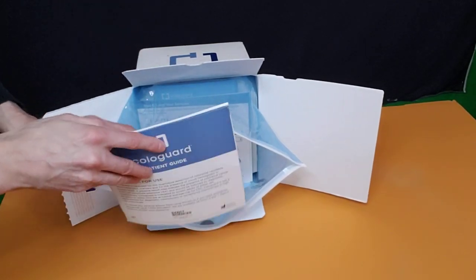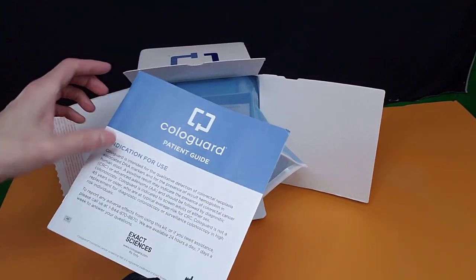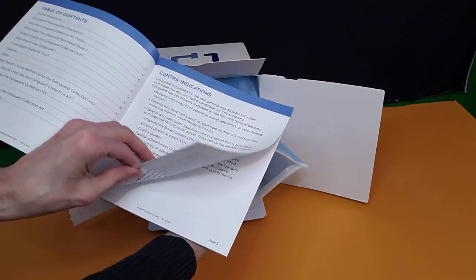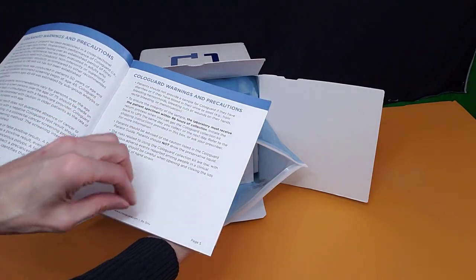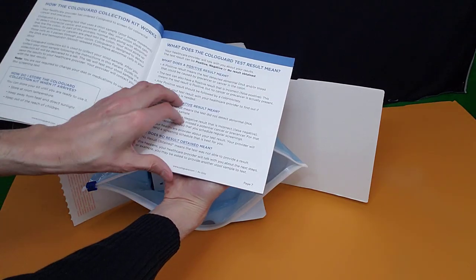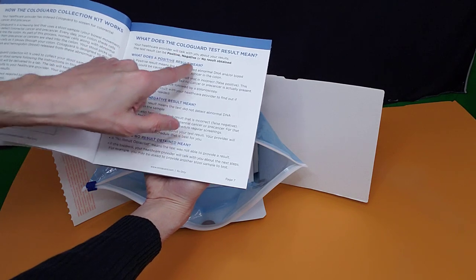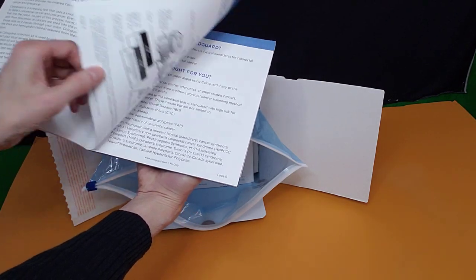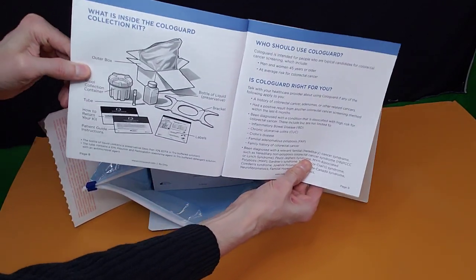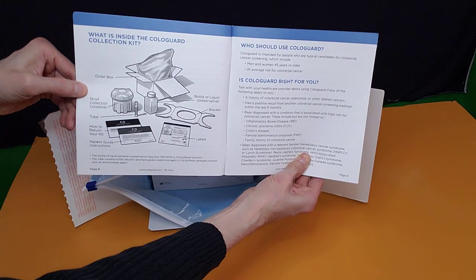So what comes in the box: you get a ColoGuard patient guide. Opening this up, it talks about the table of contents, the ColoGuard warnings and precautions, and what a ColoGuard test result means — your positive, your negative, and no results obtained.